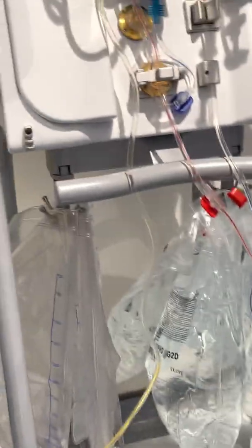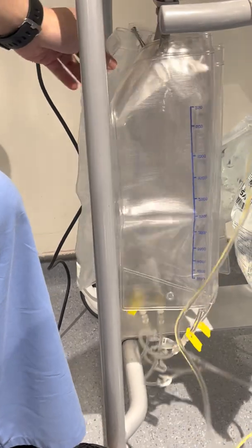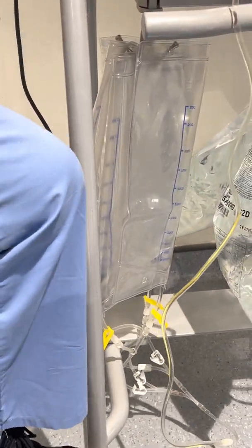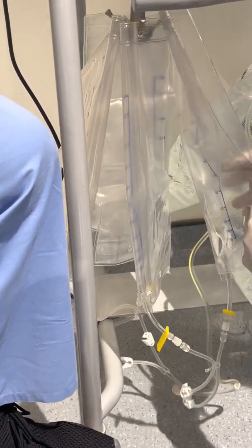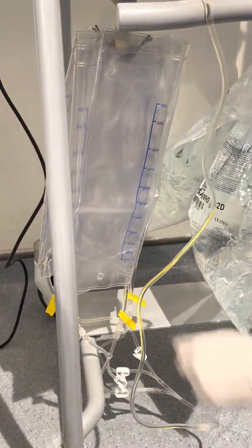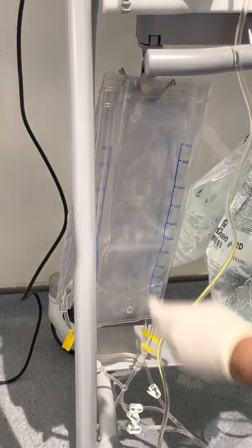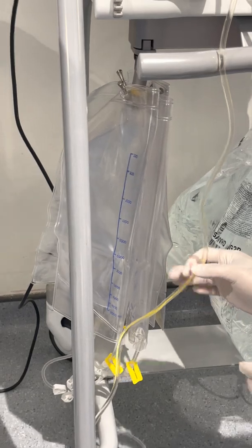But if, for example, you have 4 bags here and 2 are already filled and I want to change them right away? No, it will balance. It will not fill one bag fully first and then the next one. It's balanced, half here, half there at the same time, by the force of gravity.